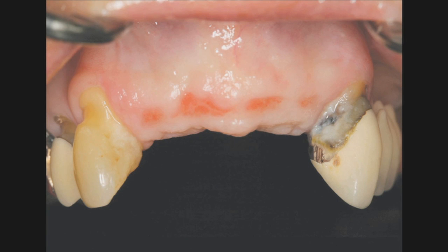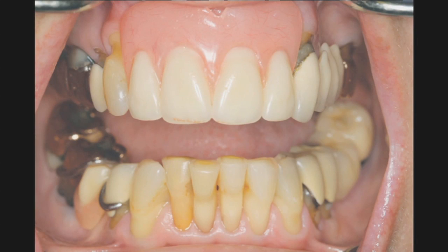So let's look at the two cases demonstrated here. The first case shows an edentulous anterior maxillary area. Teeth 7 through 10 are missing. The right and left lateral and right and left central maxillary incisors are missing. The patient lost these teeth following a very bad fall. She was wearing a flipper-type appliance for over 8 months when she came to the practice. Her quality of life was remarkably diminished, and she requested permanent, fixed restorations.